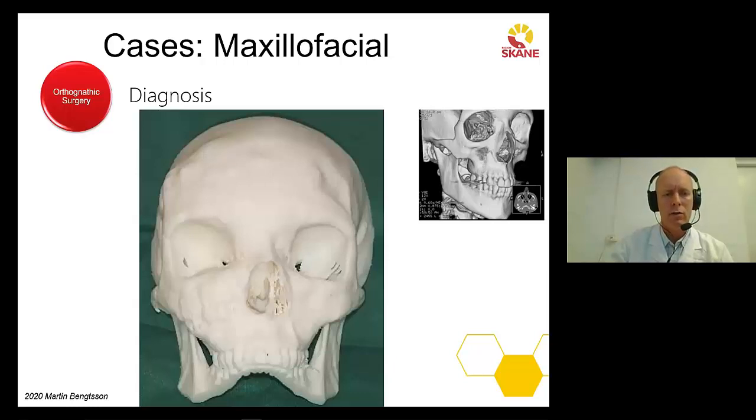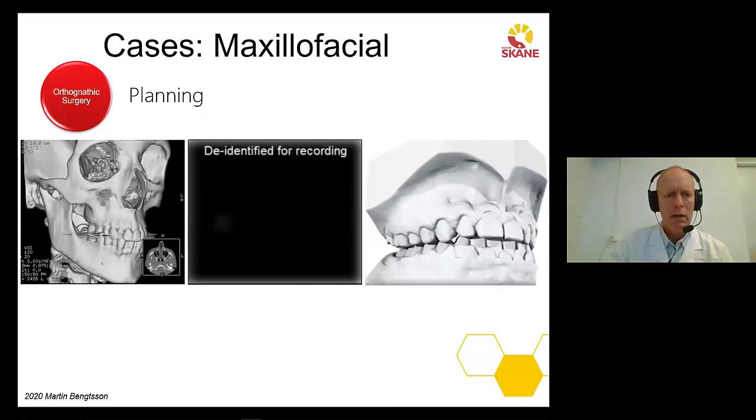This technique is not new. We have used it for almost 20 years, but formerly we used external service centers. Today, with the department for 3D printing at the hospital, we can do it more rapidly, and that is of course good for the patients.